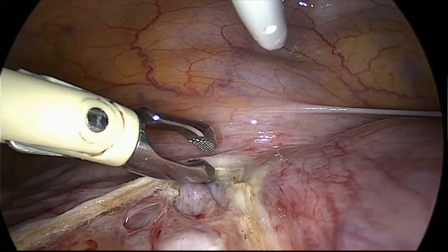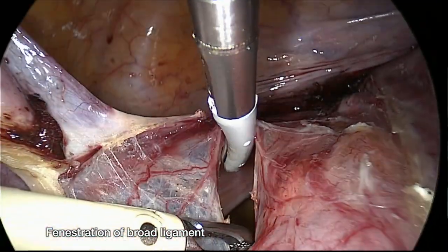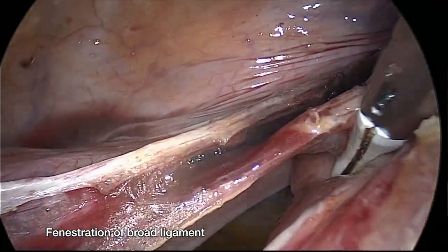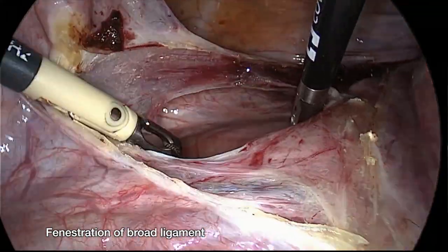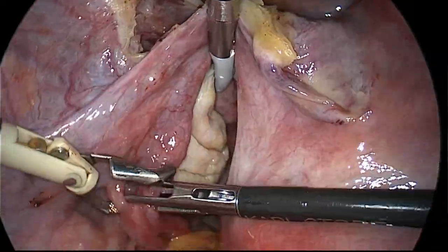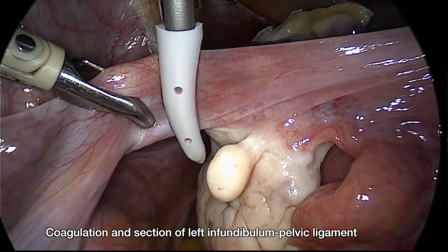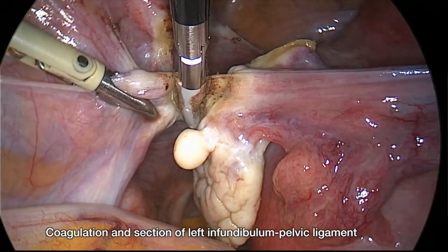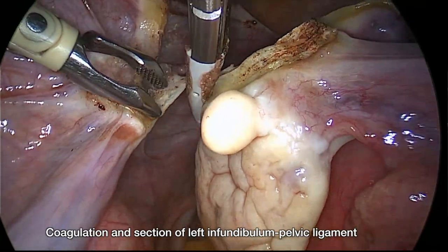After we make the fenestration of the broad ligament — in this case, because we want to remove the ovaries, we make a fenestration parallel to the infundibular pelvic ligament. The assistant grasps the tubes, and afterwards with the bipolar Maryland ligature we coagulate and cut the infundibular pelvic ligament, also known as the ovarian suspensory ligament.